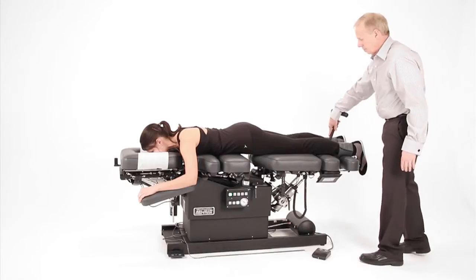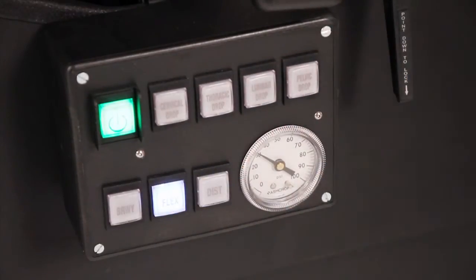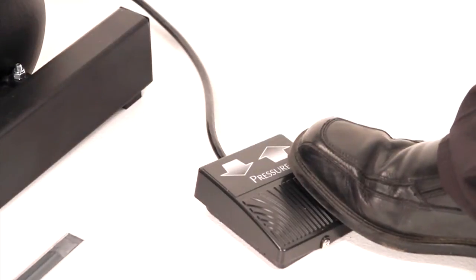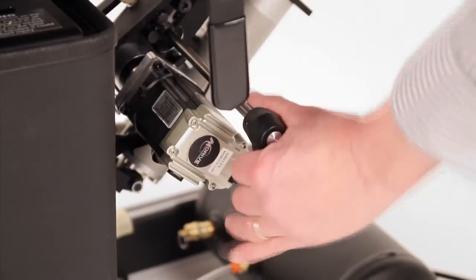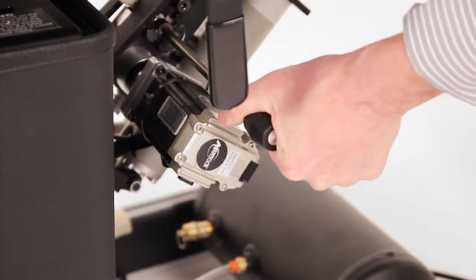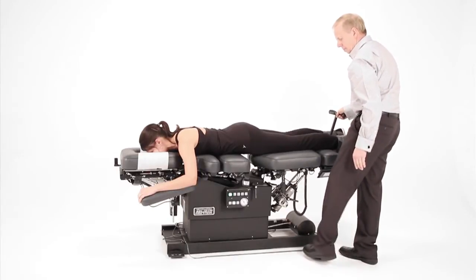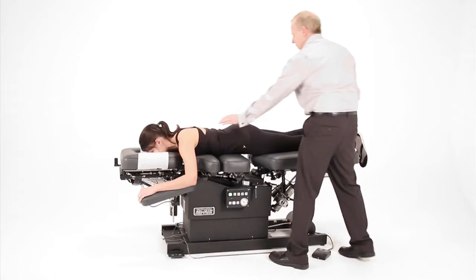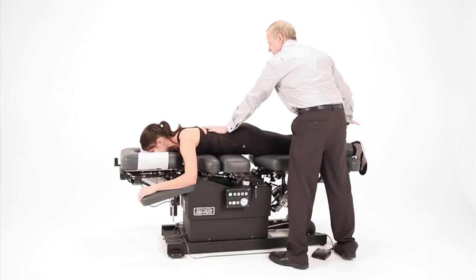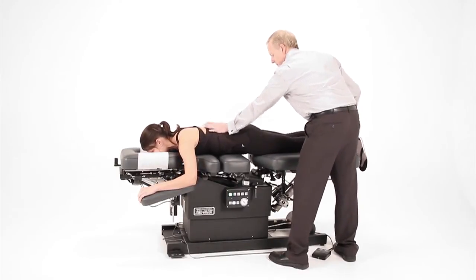With your patient in distraction, insert the tiller bar into the foot end of the table and select the flexion button. Because the Air-Flex uses air to counterbalance the patient's weight, preload the flexion air pressure to about 30 to 50 psi. While holding the end of the table, disengage the flexion handle by turning it to the 3 o'clock position counterclockwise. Then, counterbalance the table to a horizontal position using the pressure pedal by increasing or decreasing the air pressure. Once the patient is perfectly counterbalanced, you can manually flex your patient with ease.